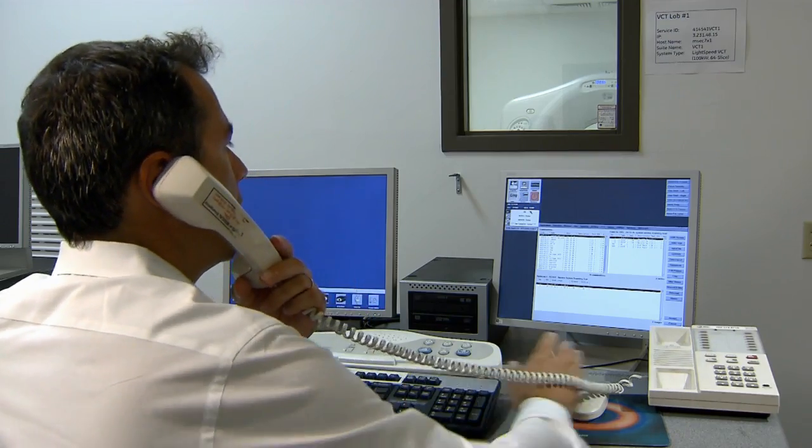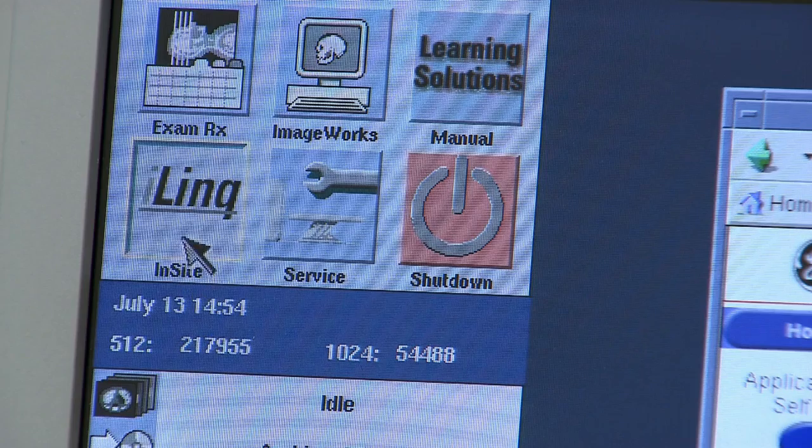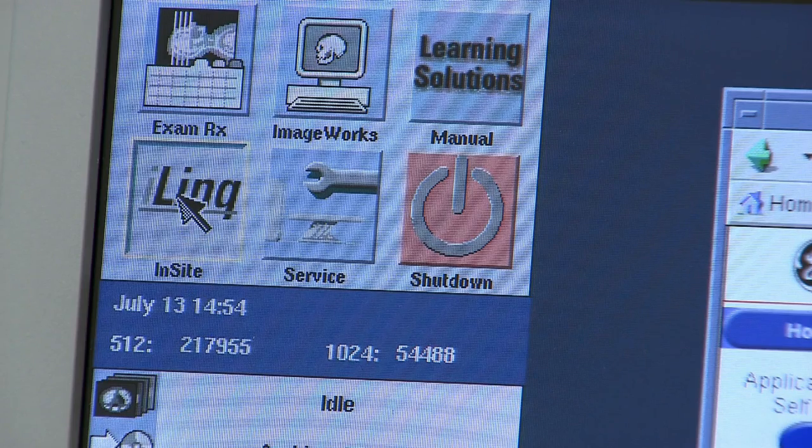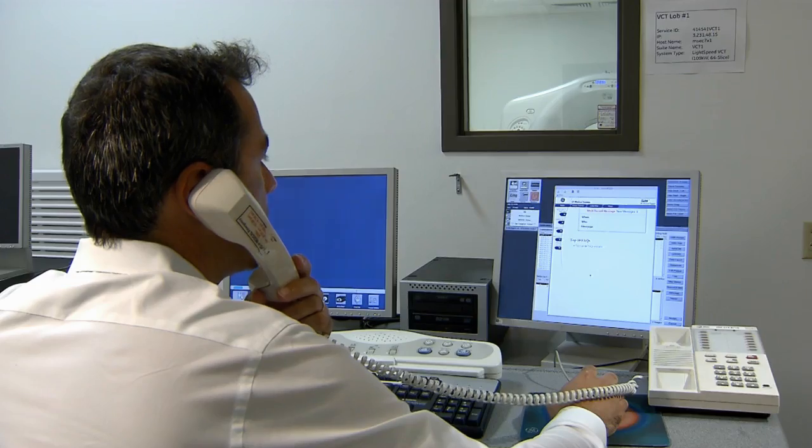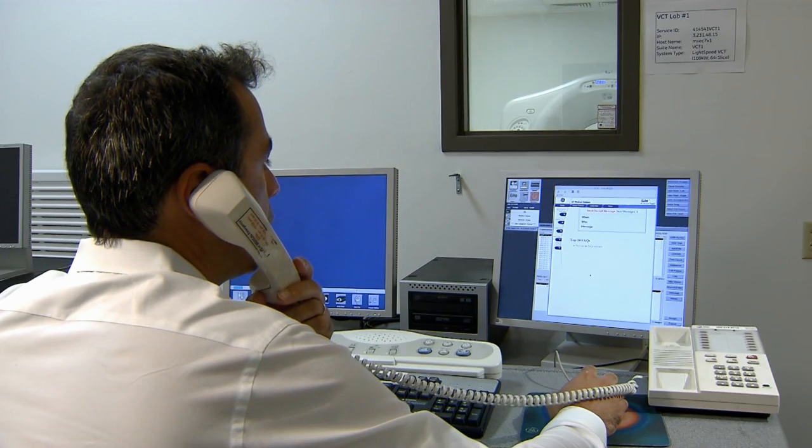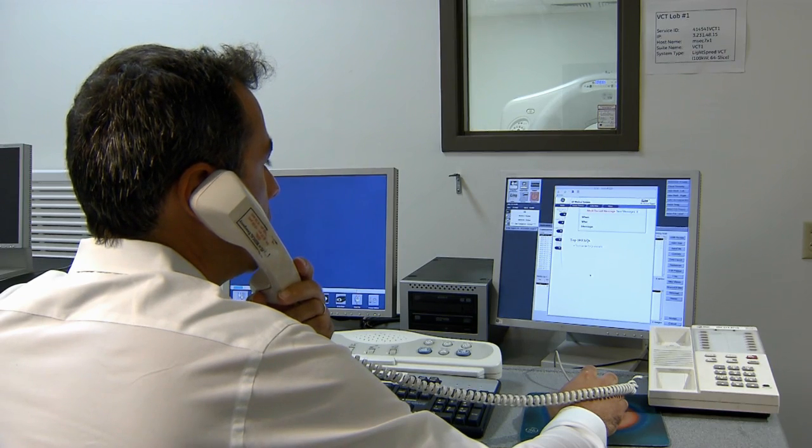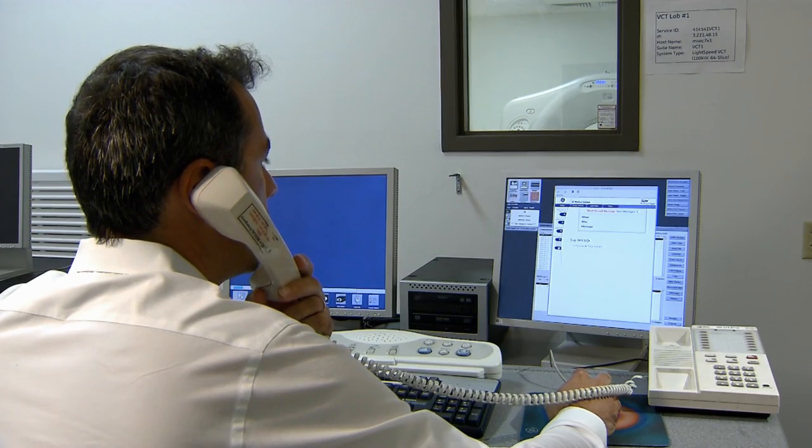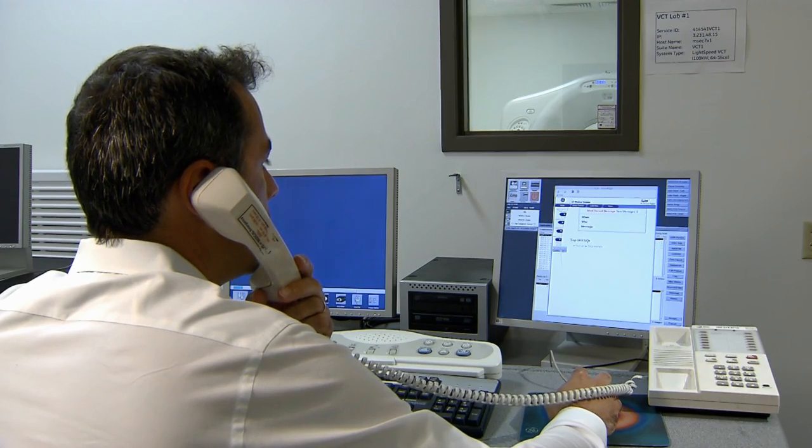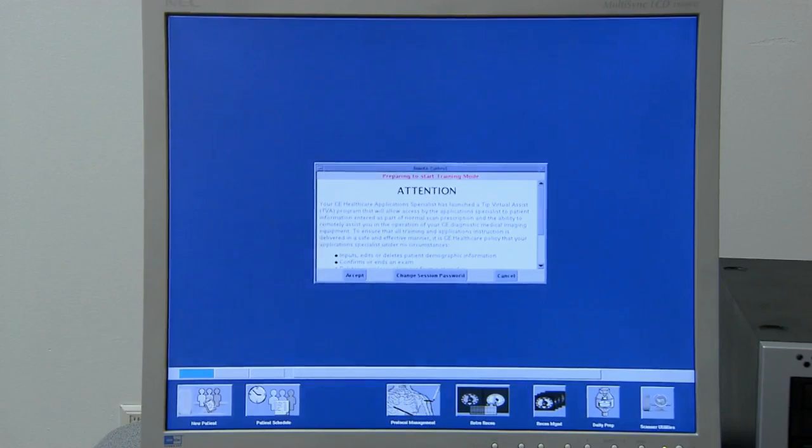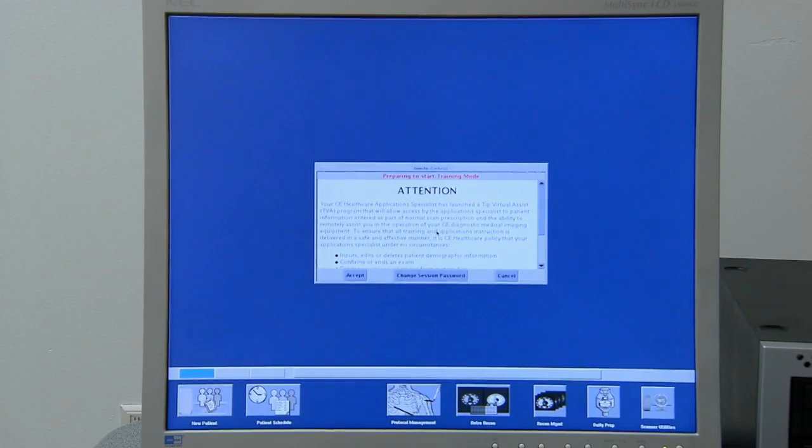On the imaging device console, have the technologist click the iLink button. The Insight web page opens. Have the technologist click the TIP virtual assist link and then click accept.